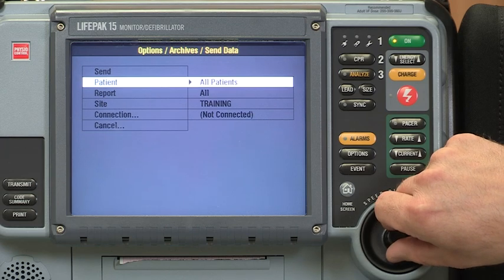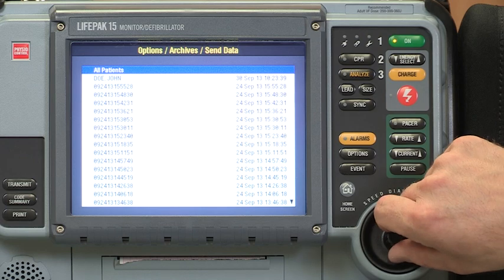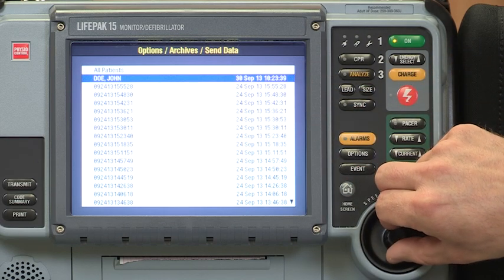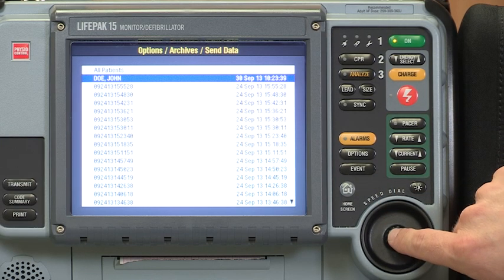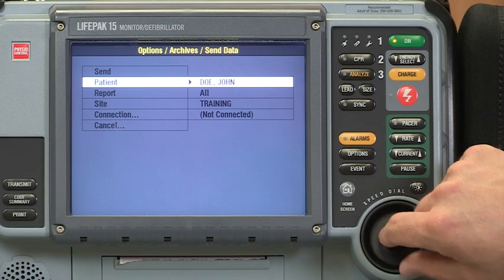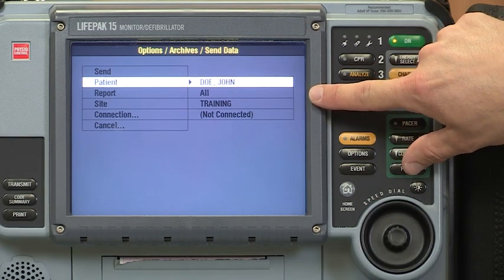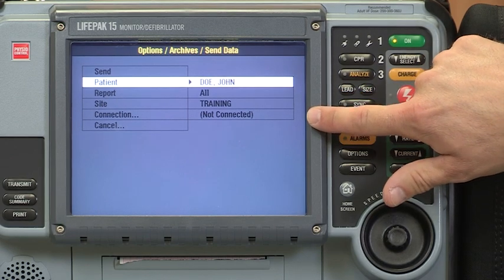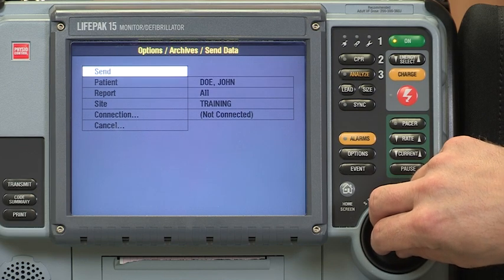Then we'll have to scroll down to patient once we're in the send data screen. We don't want to send all patients. We want to go down and select our patient that we've named, John Doe. So using the speed dialer again, select John Doe. And once it comes up, the report will show all. We want all reports. Site is training. And don't pay any attention to the fact that it says connection is not connected. That's a default of the LIFEPAK.